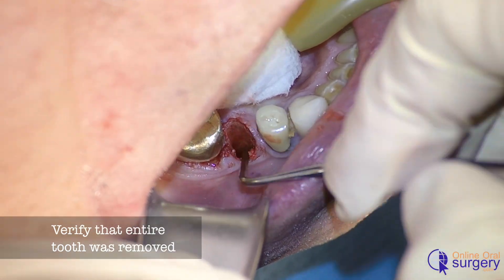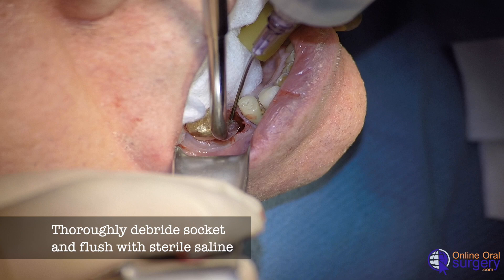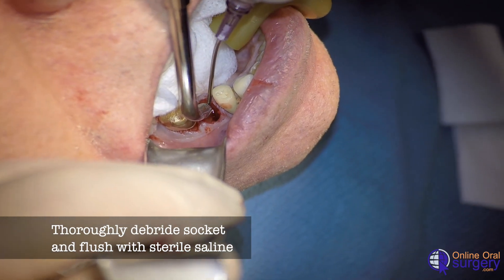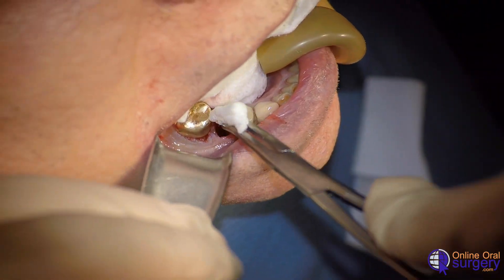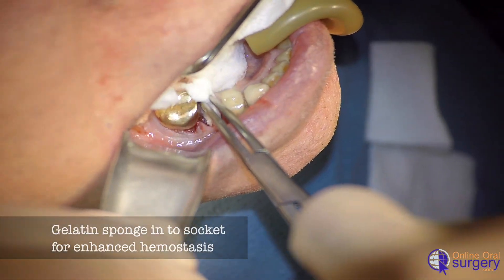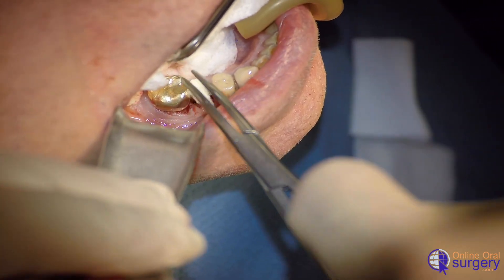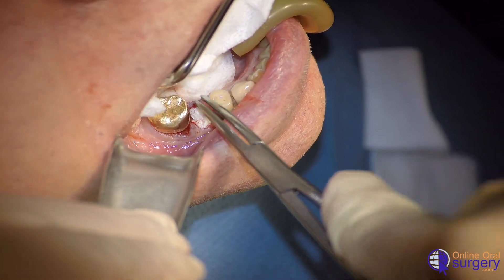Now we're going to go in and debride out the socket, thoroughly curette it with our curved curette, and irrigate with sterile saline. Once we've done this, we're going to take some gel foam and place it into the socket because this patient is on aspirin — we want to put some gel foam to help with postoperative clotting. Then we're going to put a single 3-0 gut suture in place to hold that packing in place.